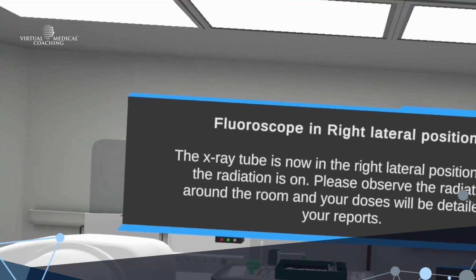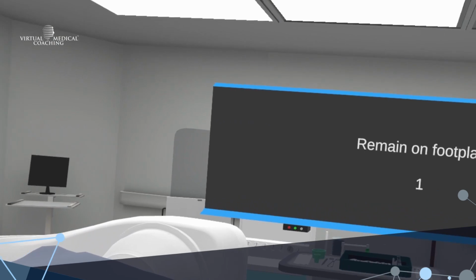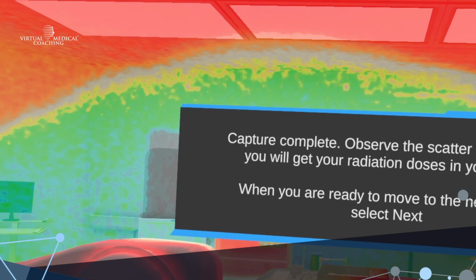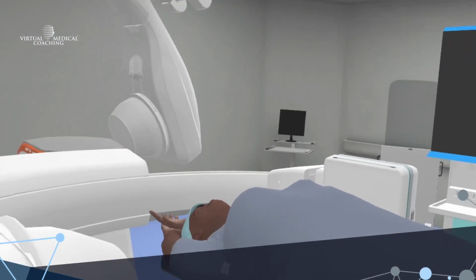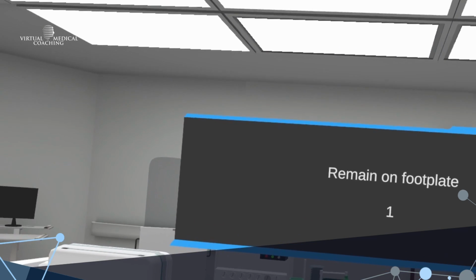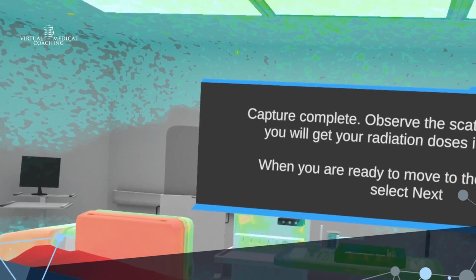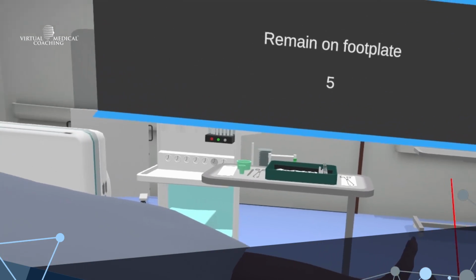Now, if you're doing this in the desktop area, you get another little dosimeter or patient view on the wall, where you get to see the eye dose, the chest dose, and the pelvis dose, because you can't look at your wrist all the time. So this one's about the collimation. You can see the tiny amount of collimation I've got there. It was really good that all three of the speakers today talk about things like laterals, collimation, frame rate, and the object image distance, because these are important lessons that we've got in the environment.